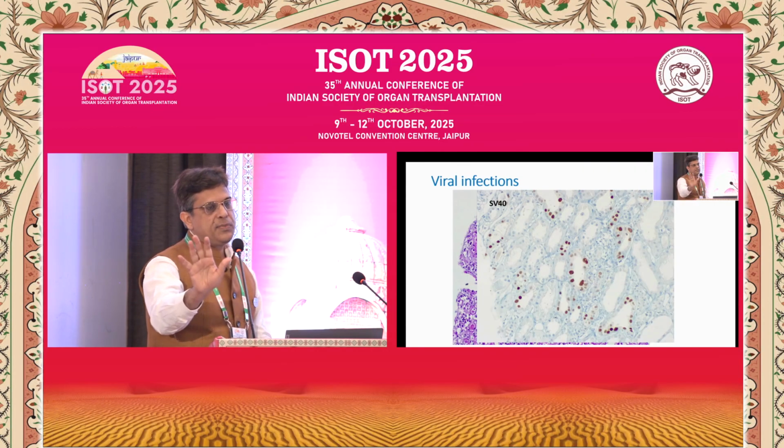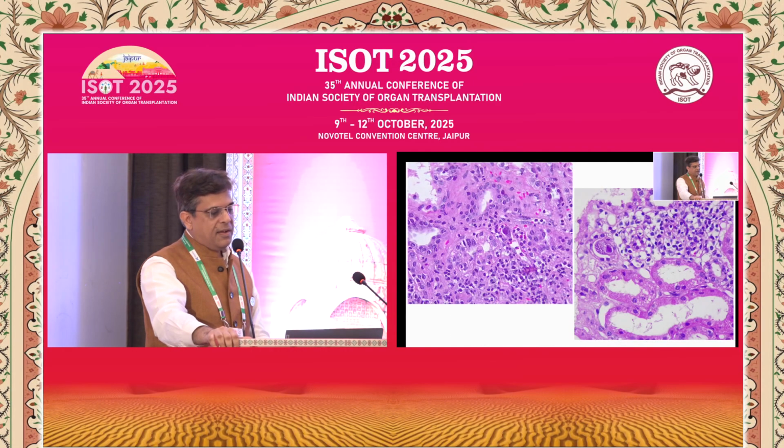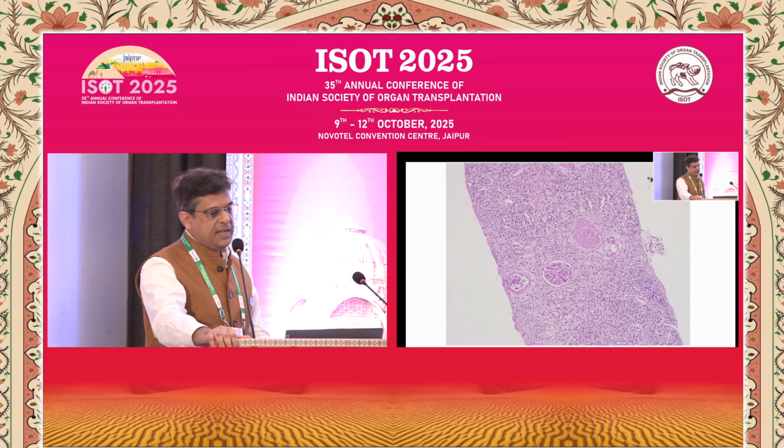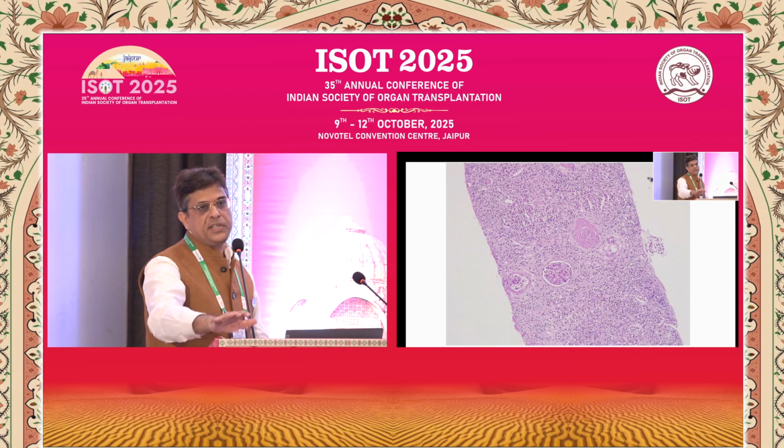Finally, viral infections and plasma cells go hand in hand. SV40, cytomegalovirus immunohistochemistry.